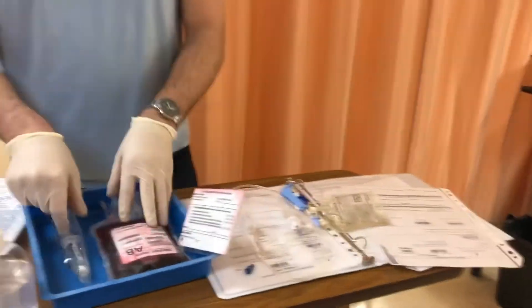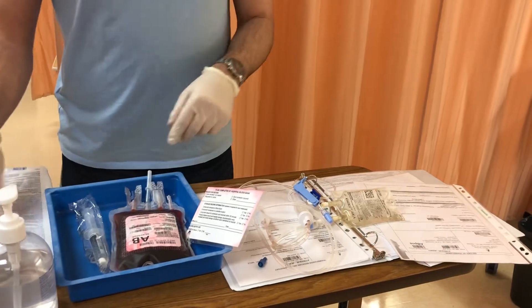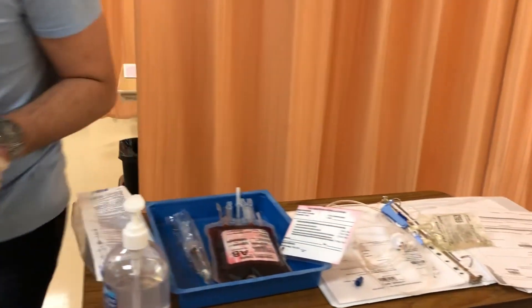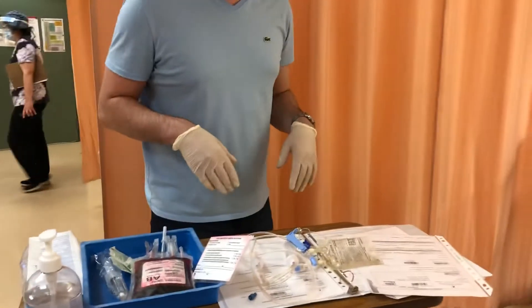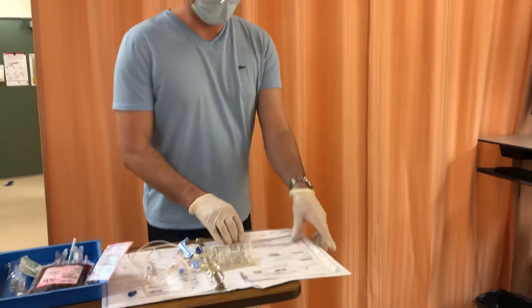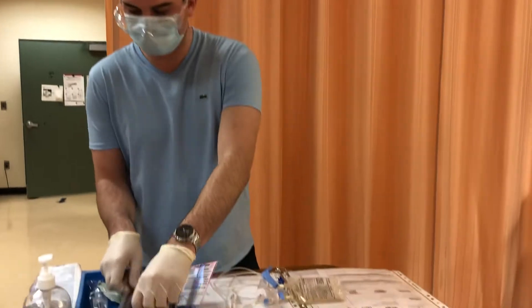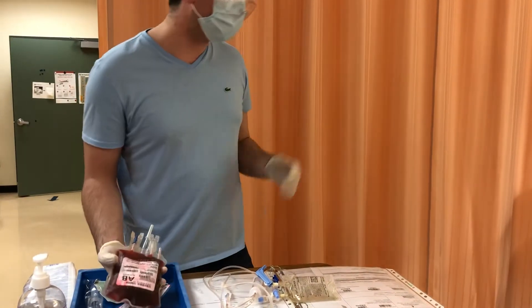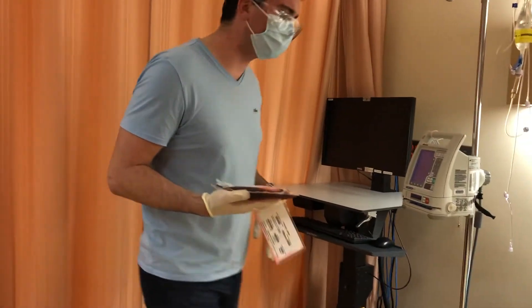Now that I have that prepared, I have a flush and some swabs. My second nurse can watch the contents while I gather supplies. Now I can enter into the patient's room. I do a quick safety check — the bed is in the low position, the patient appears fairly comfortable.